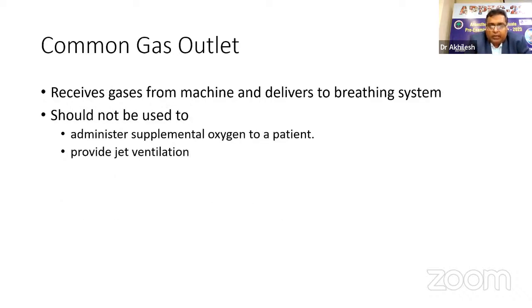Then the common gas outlet receives gas from the machine and delivers it to the breathing system. And as I have talked about, it should not be used to administer supplemental oxygen or provide jet ventilation.